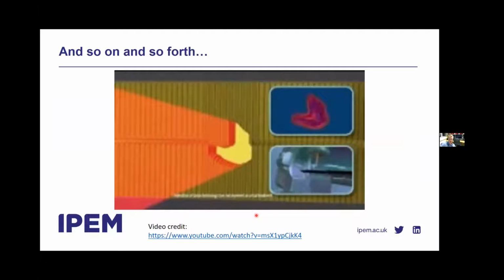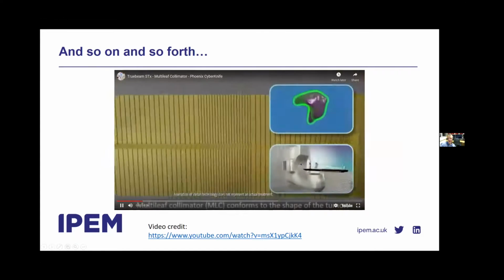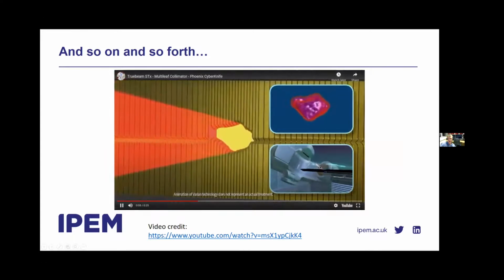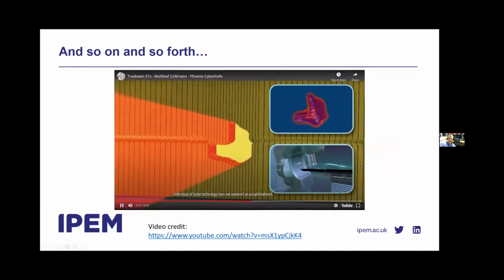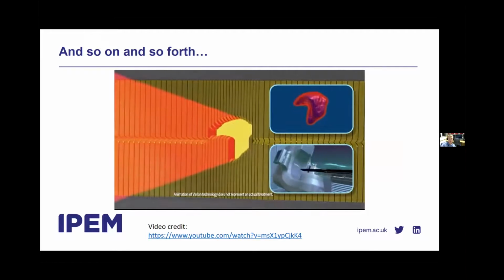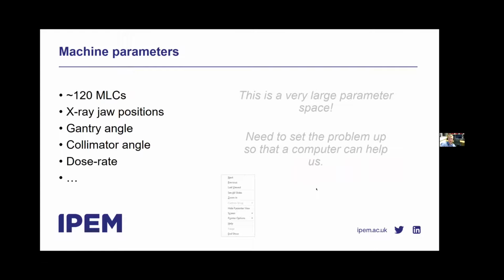If you recall this video that I showed at the start, you'll remember that most modern radiotherapy is actually delivered in an arc. We exploit every possible gantry angle, and we adjust the MLC aperture to suit the gantry angle that we tend to be at. And hopefully it's clear now that the logical extension of going from one field to four fields is to go for an infinite number of fields, or essentially infinite. And when we arrive at this space, we end up with a very large parameter space, and it'd be unwieldy for us as human beings to choose each one of the machine parameters by ourselves.